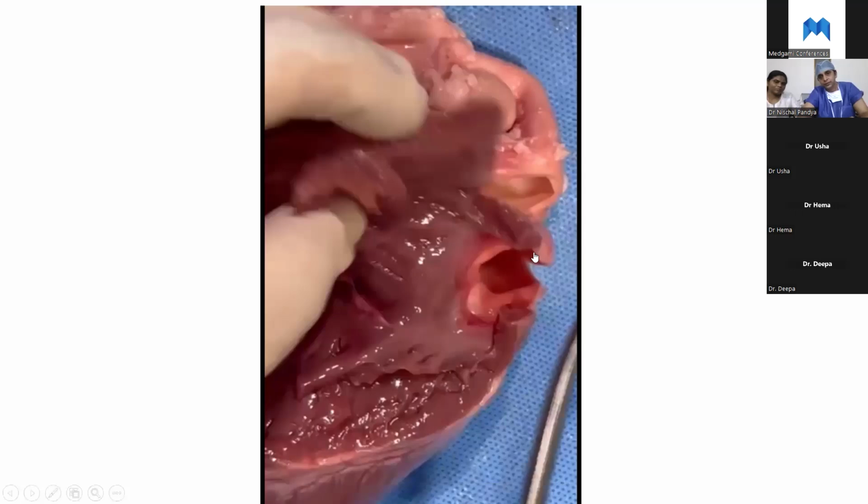Whereas the portion that comes onto the septal area over here, a little more dangerous part, this is your septal leaflet, the septal bands. Again, at this point will be the ones that go to the conus and the conus septum again. So these would be thickened. These would be another set of septal bands that we sometimes have to cut. Here we have to be more careful, because if we cut into these too deeply, we would go right into the LV. The conus area, as I told you, would be thickened at times. So we just sometimes end up shaving this bit off sometimes.